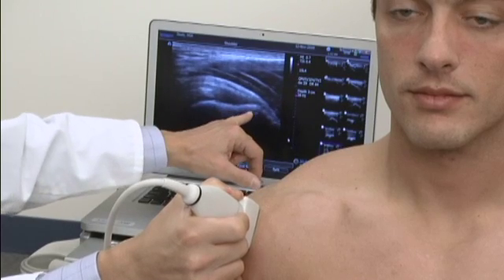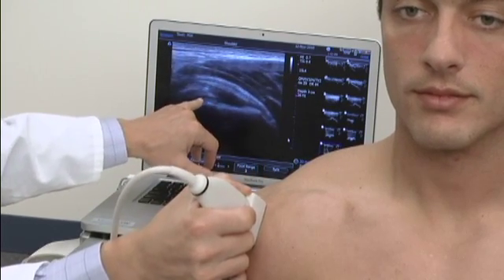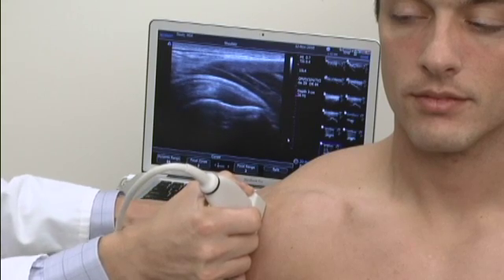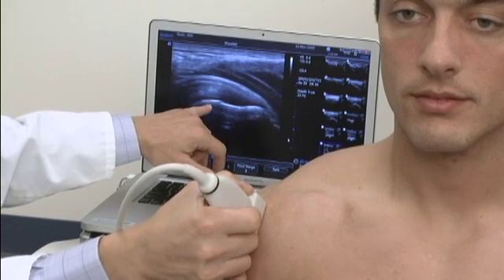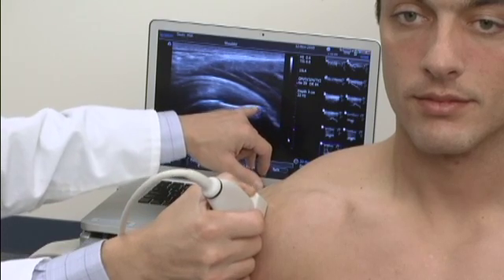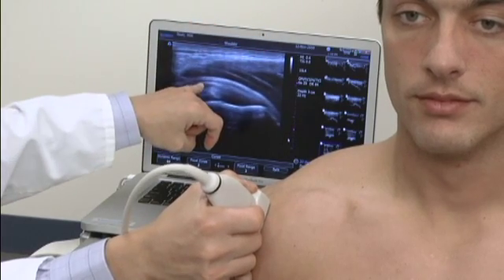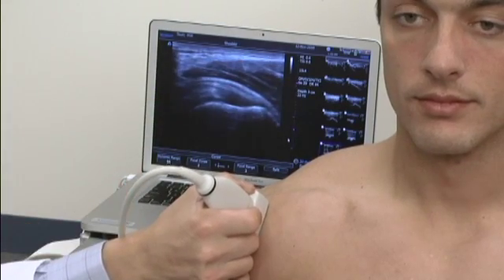This represents the greater tuberosity, and this represents the humeral head with hyaline cartilage back here. As I adjust the probe, you can see how dark that is. I'm going to bring down the focal zones to that same level to improve our view. Here is the articular cartilage, this is the anatomical neck of the humerus, this is the greater tuberosity, and here is the supraspinatus tendon. This bright area above it is peribursal fat, the little black line below it is actually the subacromial subdeltoid bursa, and this represents the deltoid here.